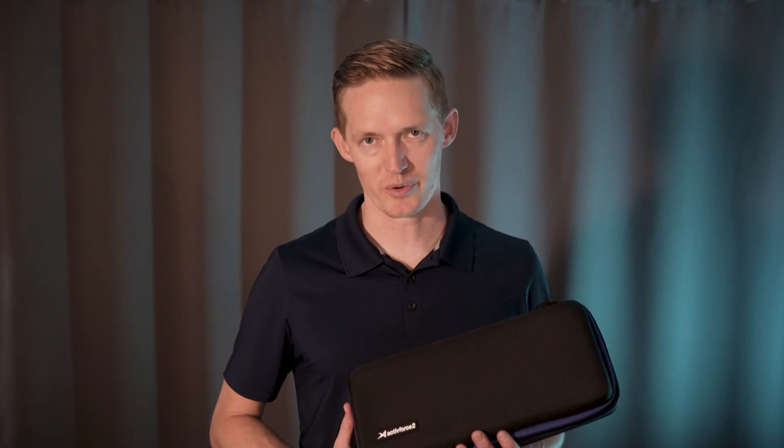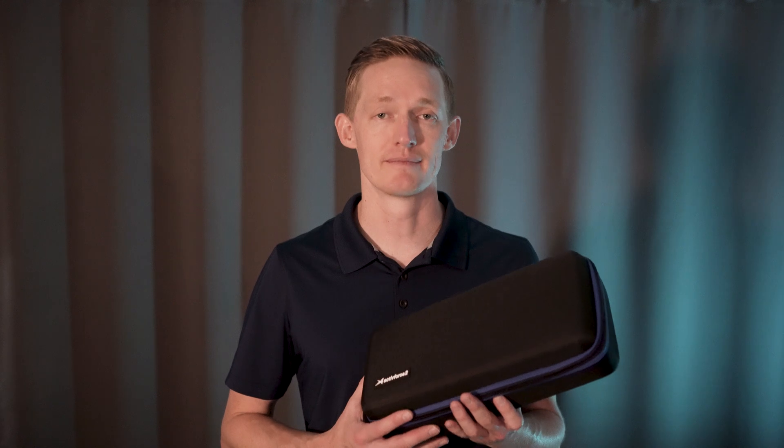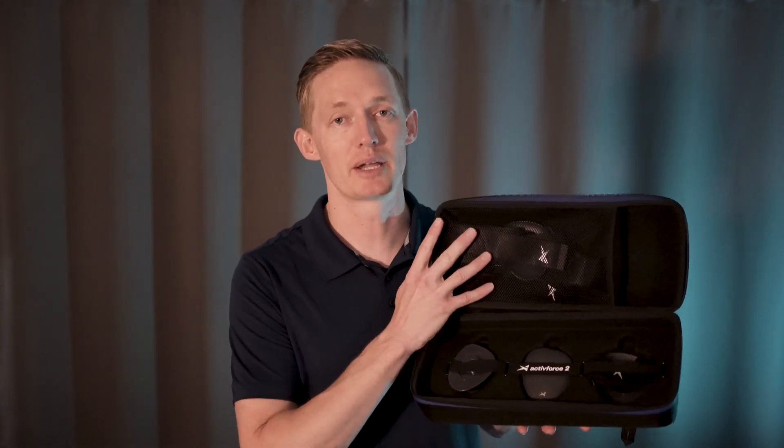Hello and welcome to the ActiveForce 2 walkthrough. I want to take a moment to show you around your new ActiveForce 2 kit. When you first open your kit, you'll see that it comes with your device, your hand strap, round pad, soft pad, leg strap, and a belt loop plate.